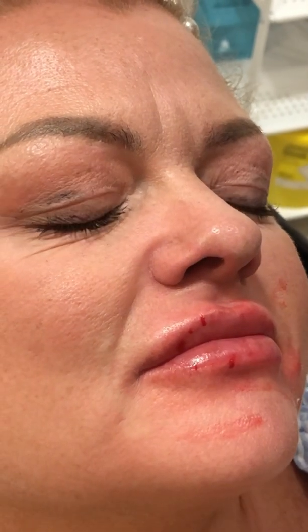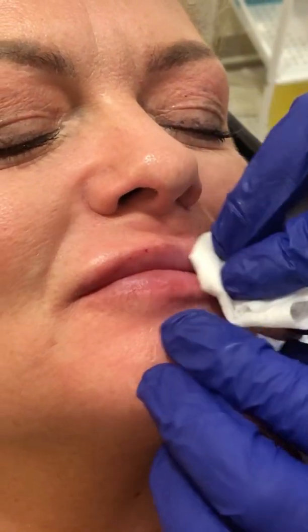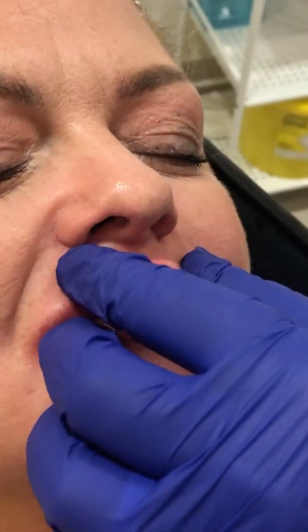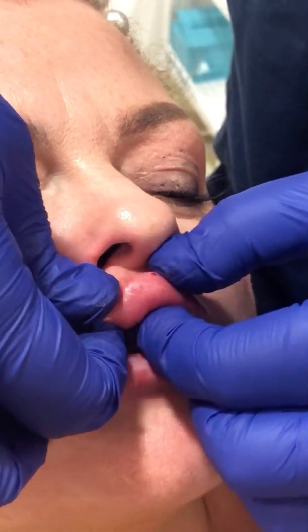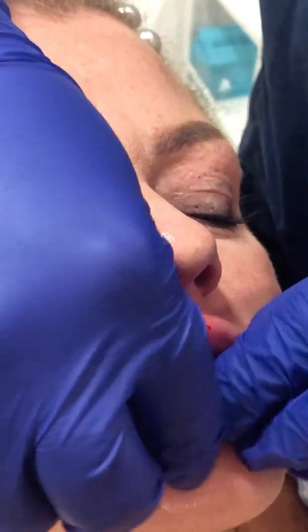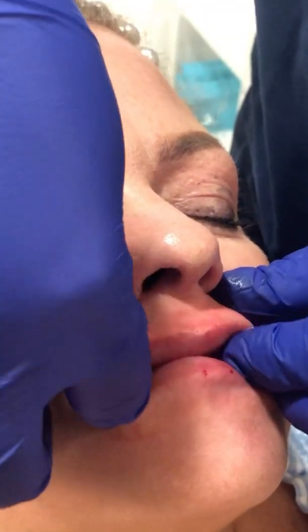I'm going to get a wet wipe and give this all a wipe round. The hyaluronidase is in and we can already see some of it starting to disappear. I'm going to give this a good massage just to help move the hyaluronidase around, and the same on the bottom lip — just gently massaging this.